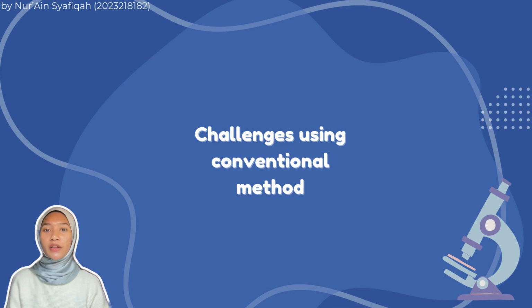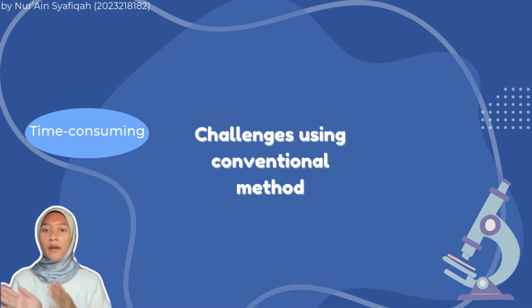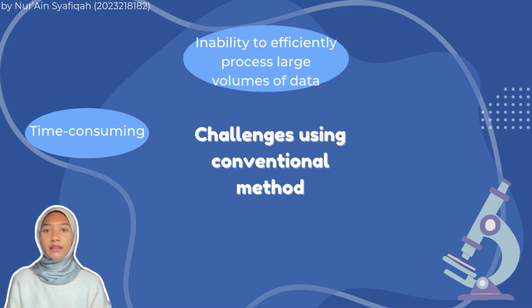One of the most significant issues with the conventional method is that it is extremely time-consuming, as pathologists need to examine tissue samples one by one, hence delaying the diagnosis by physicians to come up with the right treatment. Next, the inability to efficiently process large volumes of data.